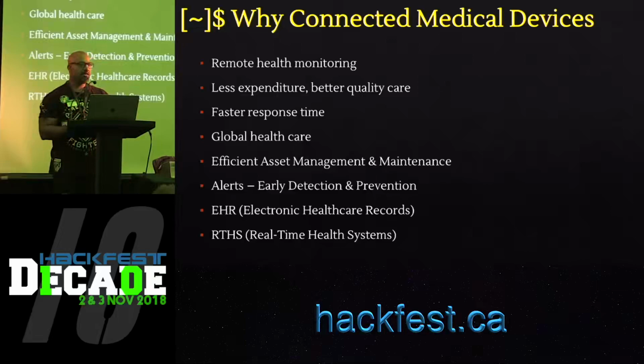If you look at the packet here, we could see the pump serial number, the current time, wireless access point data, IP and MAC information, maintenance due date. And in the end, there was some random string, which took us a while, but we figured that random string is actually an XModem checksum. Because it's an XModem checksum, it was easy to spoof. So we were able to retrieve packets, receive packets, modify them, and then push them back to the pump server after fixing the XModem checksum.